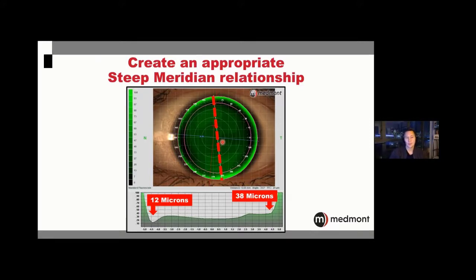If you add the two of those together, you've got 50 microns of fluid if you average what's at the top and what's at the bottom. Ideally, you want to stay around 20 microns of fluid at 12 and 6 o'clock at the optic zone junction. That's here and here. When you're greater than 20 microns, that gives the contact lens a little more room to rock back and forth. So this toric lens may not be toric enough for the eye.